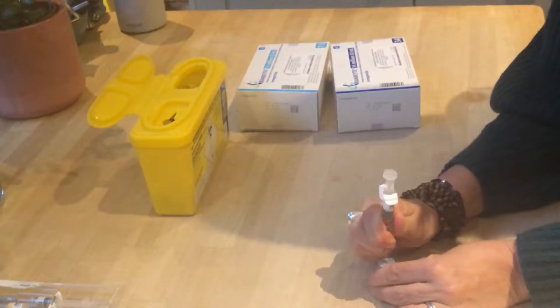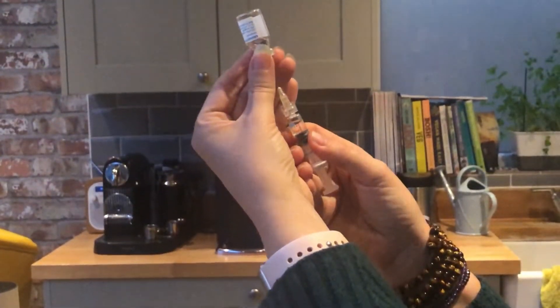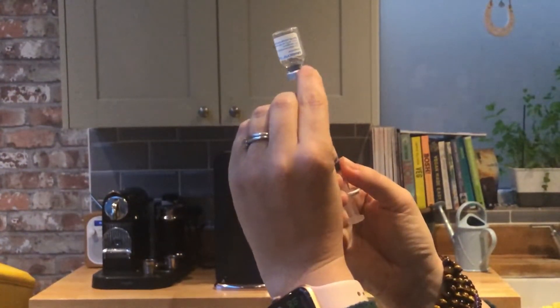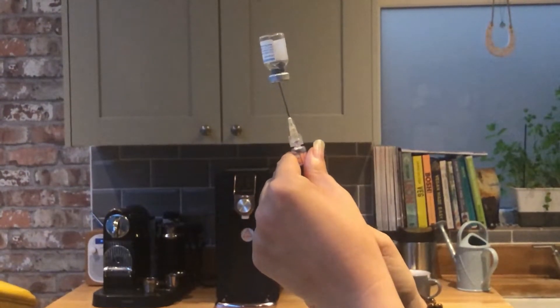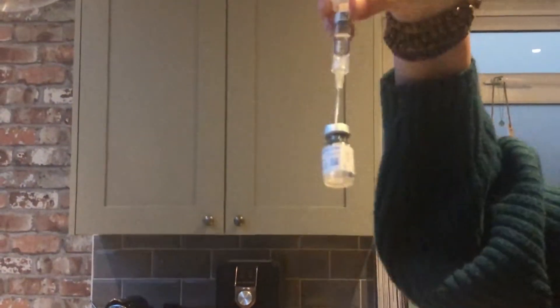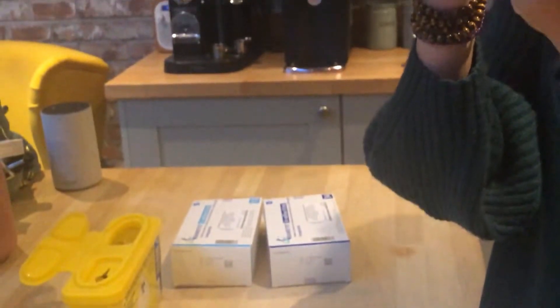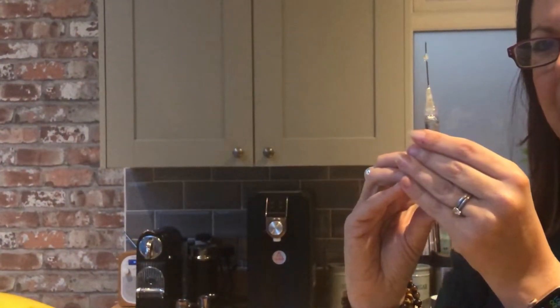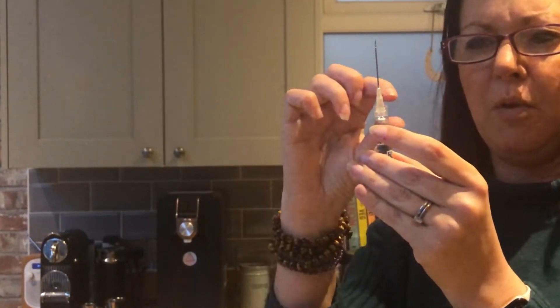We'll do the same with the next bottle. Pierce the top with the same needle. There's a grey seal each side but there's a gap — you want to be looking to see the needle in that gap. Then just pull it down so it's all in there. I always tip the bottle up and make sure there's no drips. Then you take the needle out — make sure there's no air bubbles. Give it a little tap and make sure the solution is to the top, so there's no big air gap.